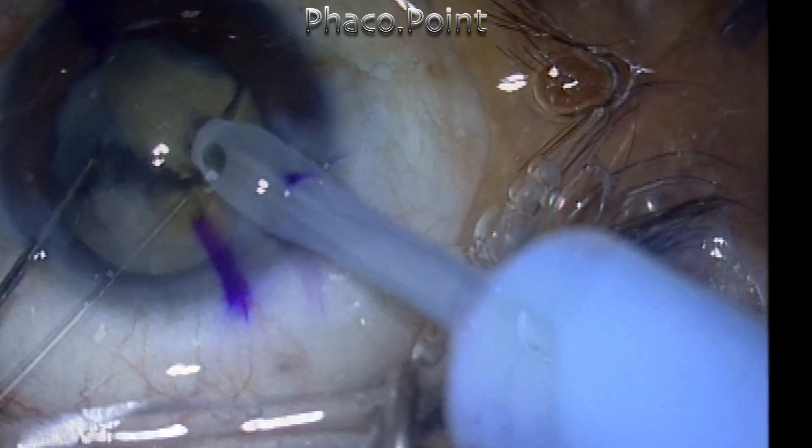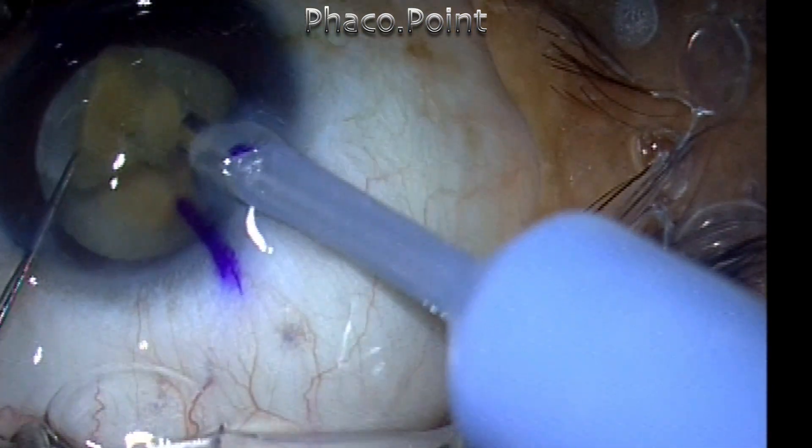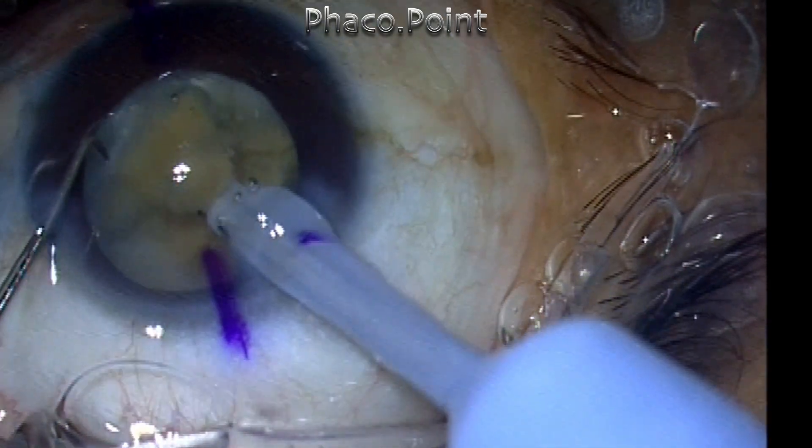Now, once you have broken it down, with the same multi-burst mode, I'm emulsifying these fragments once they have been created.